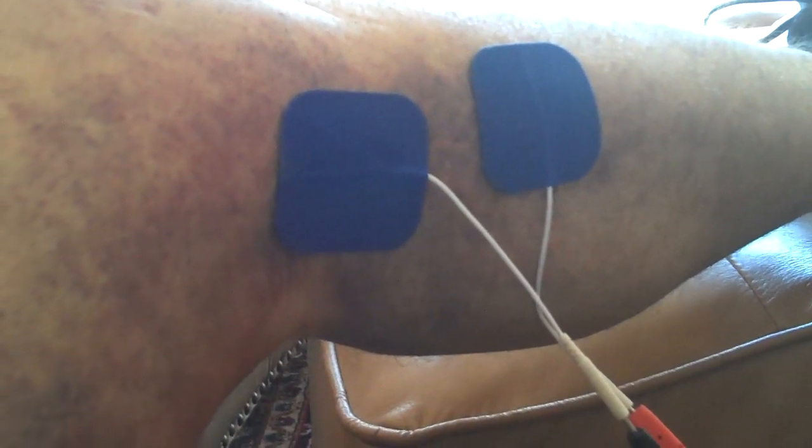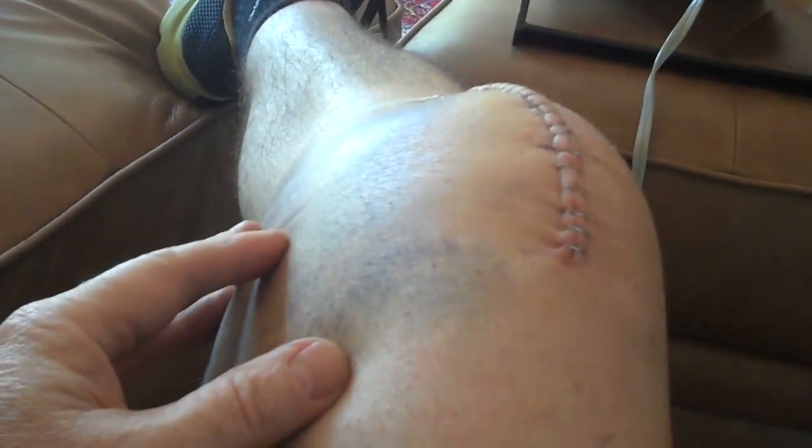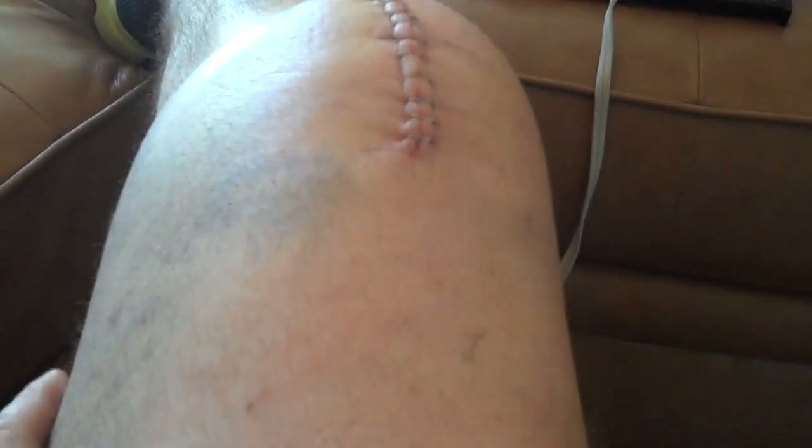Today I'm going to stimulate this area for a while and then eventually move the electrodes up to the top of the tibialis — probably in here — which will feel good. Later I'm going to come over here, which is still really quite swollen, and do a little bit of quadriceps work just to strengthen that.